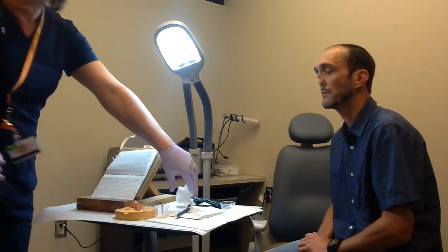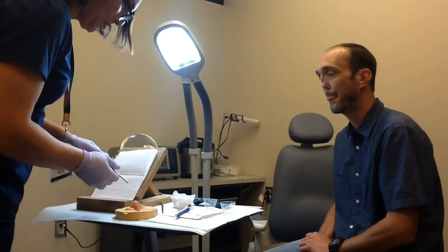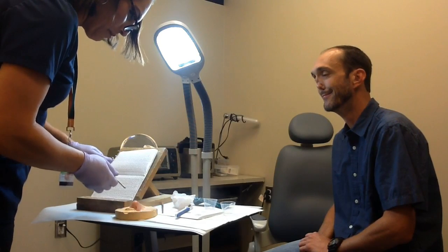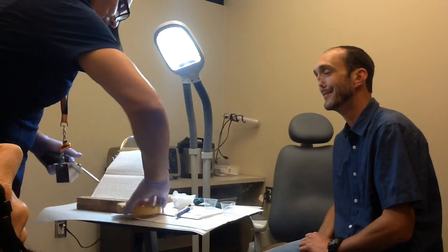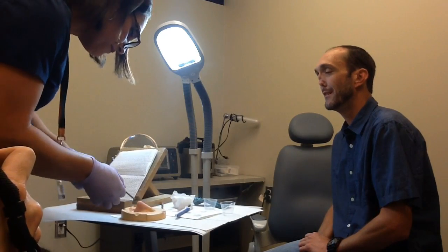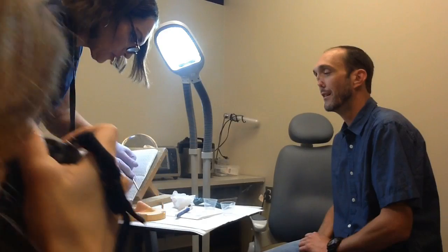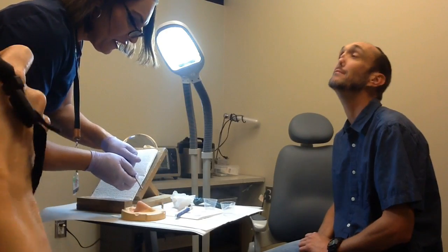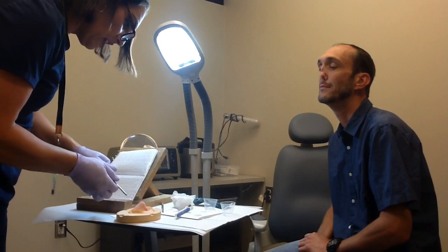So now what's next is the atomized sugar trick. Here we go. So don't be scared when it looks like it's powdered sugar, okay? And it looks like a crepe or something. What this is doing is it's leaving a fine texture on it when it cooks, and then once it's done cooking, I just wash it off and there's no shine. But it doesn't leave a color.